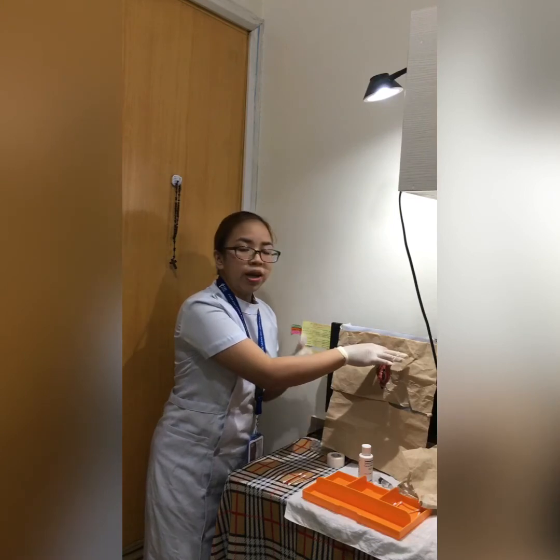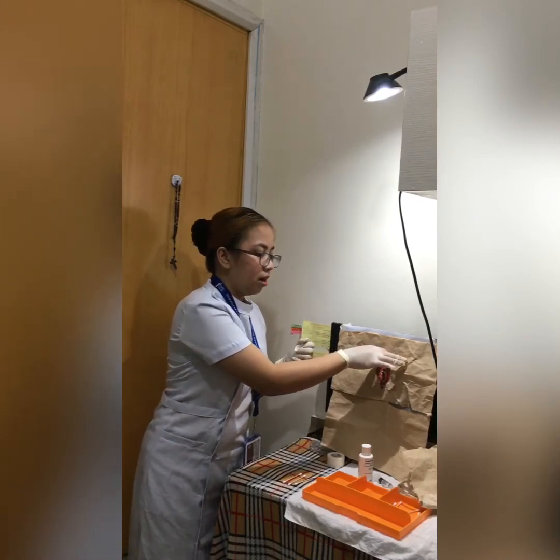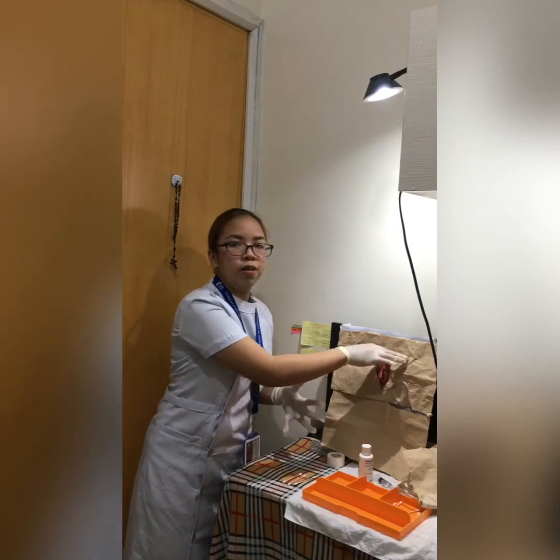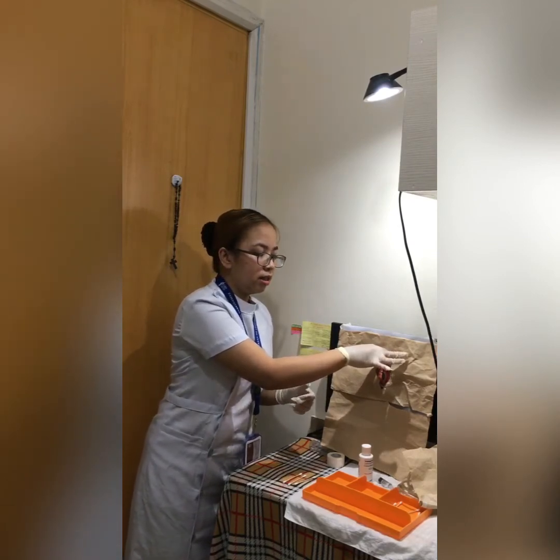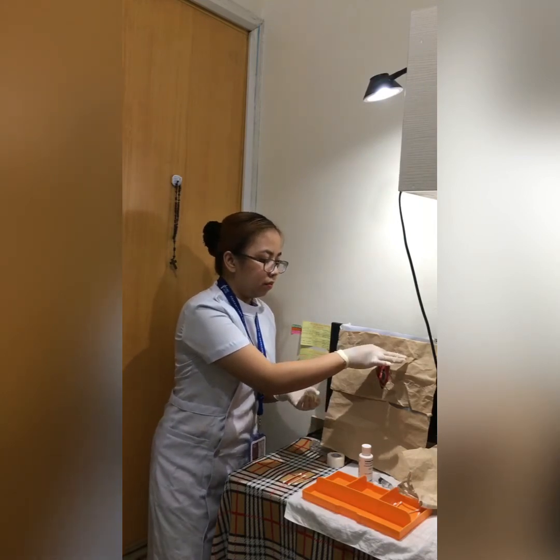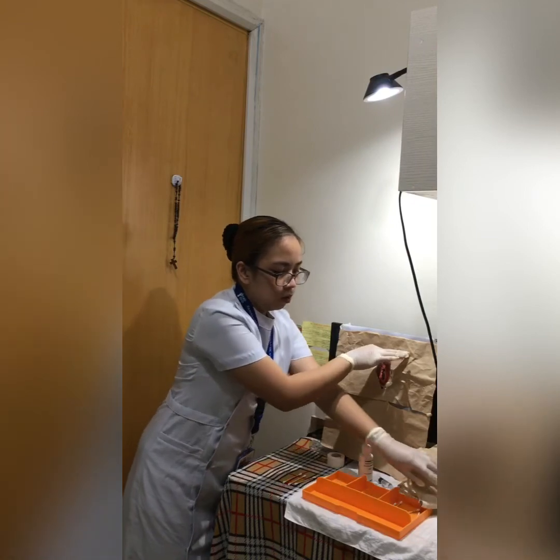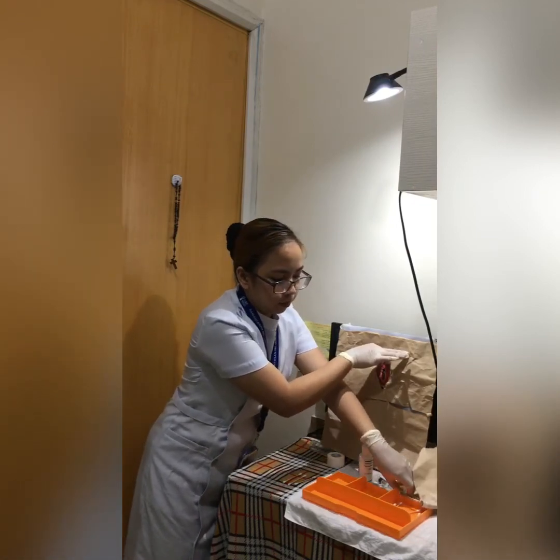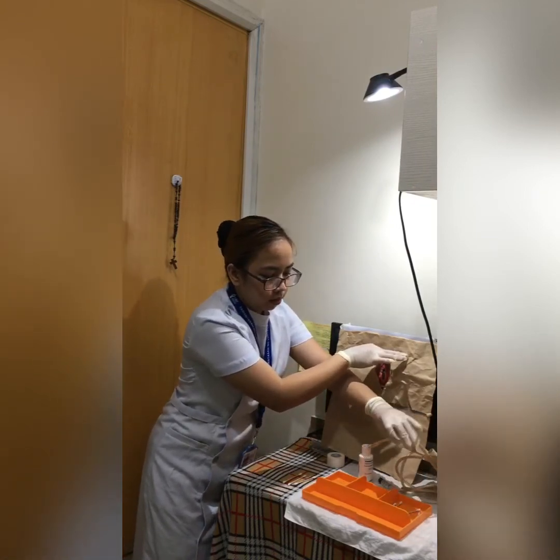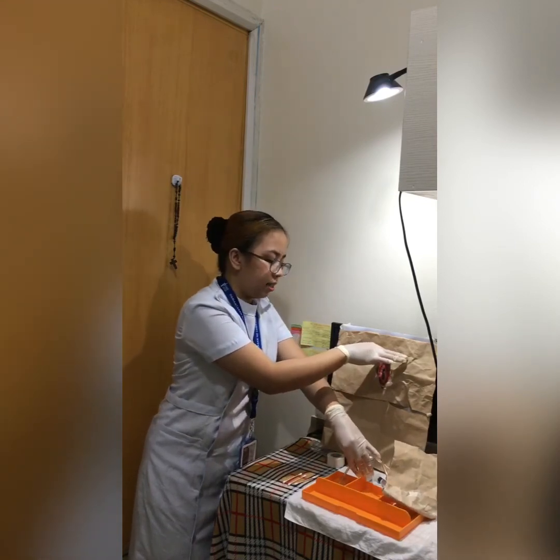My non-dominant hand is already contaminated with dirt, so this is already dirty. Next, we're going to lubricate the catheter about 1 to 2 inches.